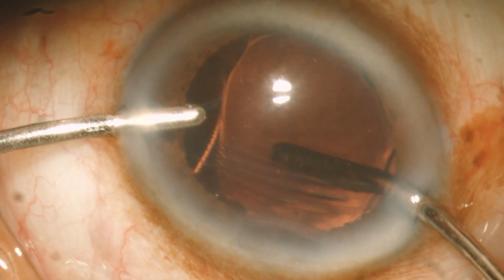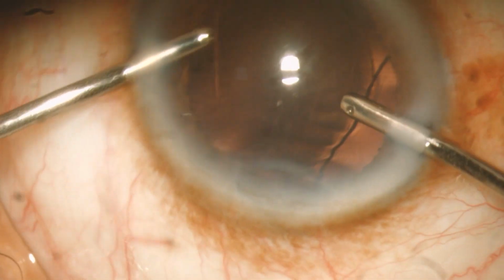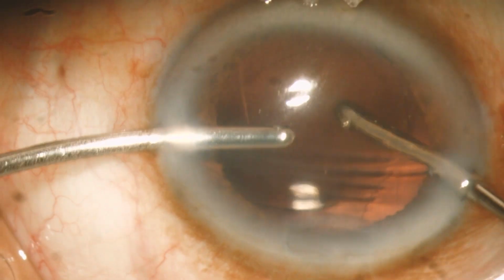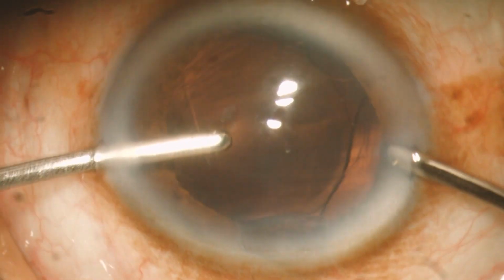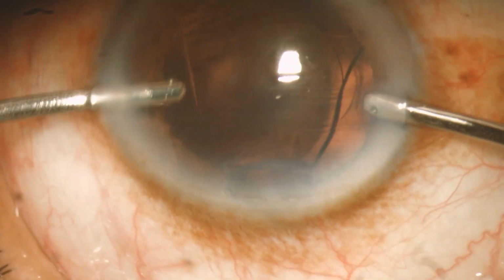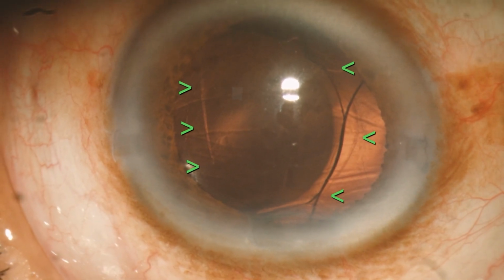something is not right. We can see that the IOL is not behaving properly and that the capsular bag is strange. We try to put the IOL in the center more gently, but suddenly we check with more attention and now we're gonna see with arrows that there is a PCR.